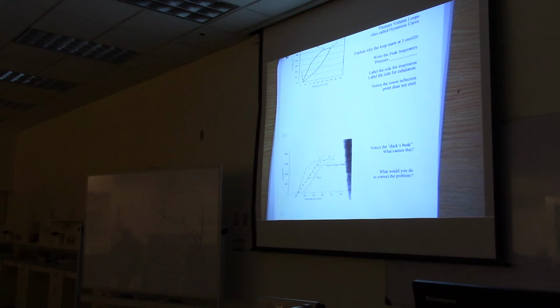So a lot of pressure building up when the remaining tidal volume is going into the lungs. All right, you got that written down?